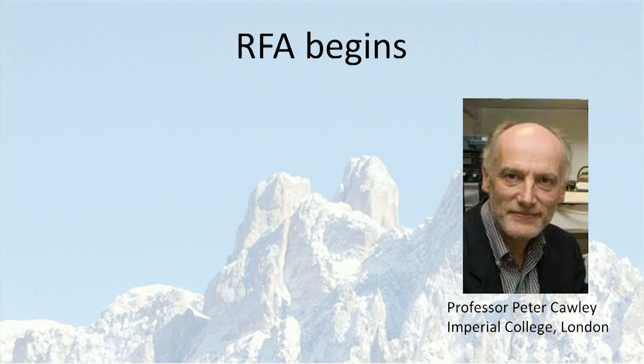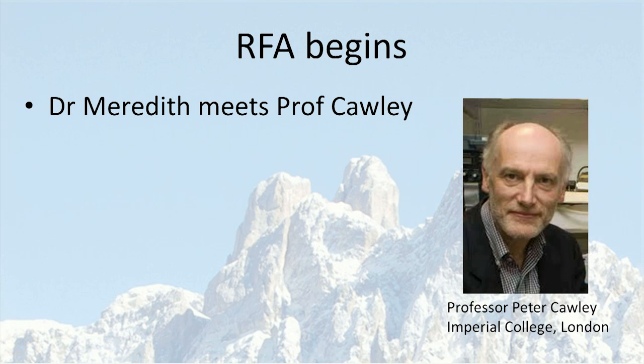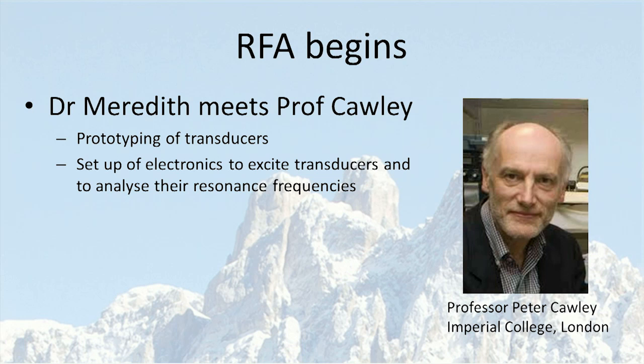Peter is at Imperial College in London, and his speciality is vibration engineering. So these two guys meet, and they start to think about how to do measurements using resonance frequency analysis on dental implants. They do some prototyping of transducers. They have to do a setup, of course, of electronics to excite the transducers and to analyze their resonance frequencies. And this is before mobile phones were a great product. This was before electronics were very, very small and fast.